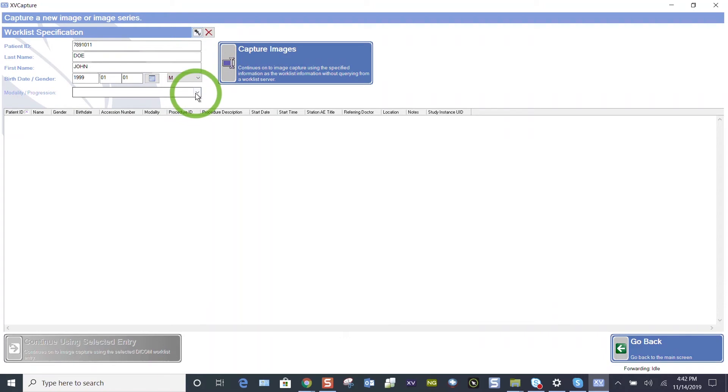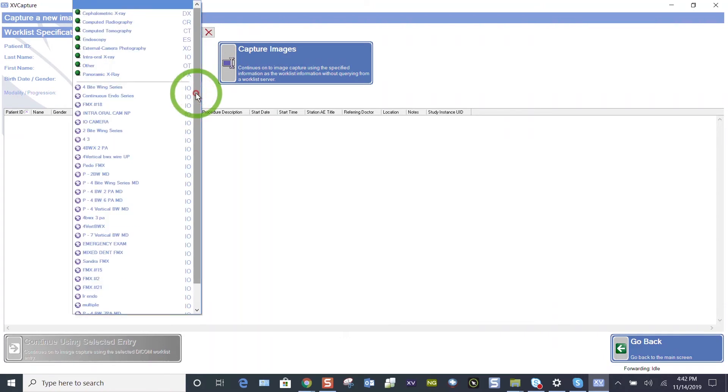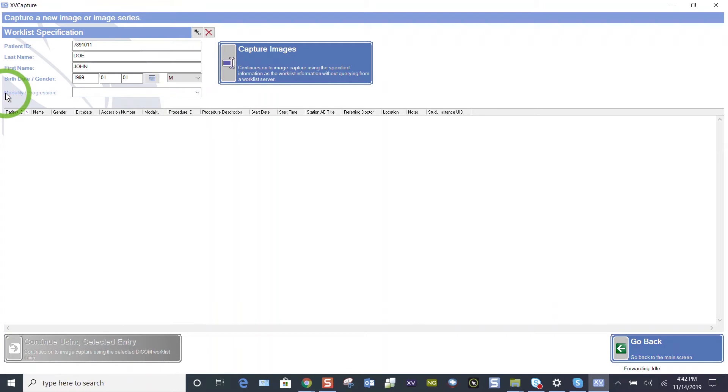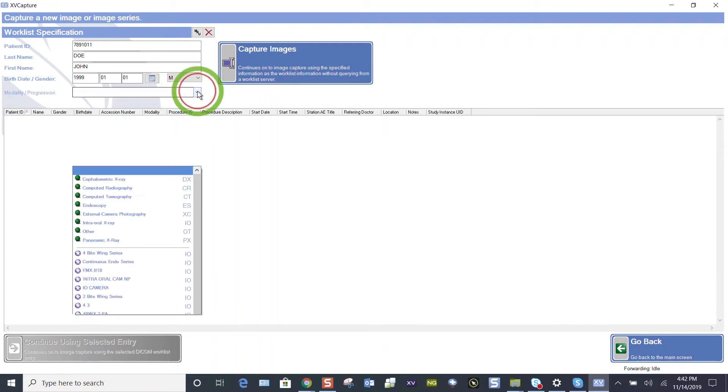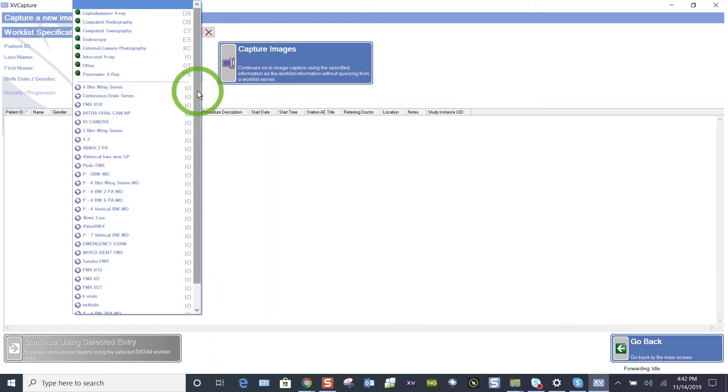Whether you're using digital sensors or phosphorus plates, let's find the drop-down menu. This is the modality and progressions. Progressions are our layouts. Let's find our FMX 18.